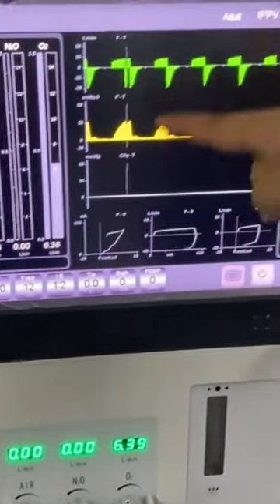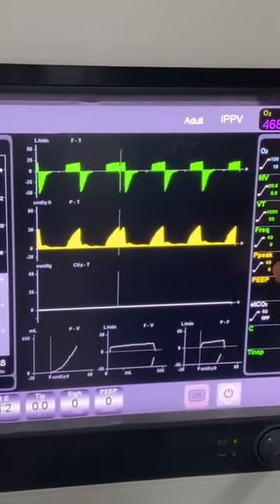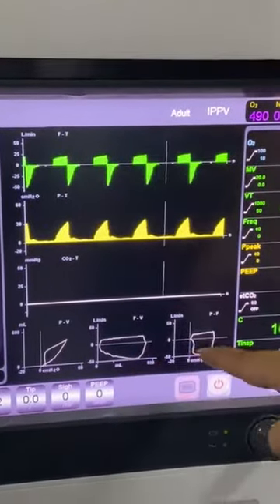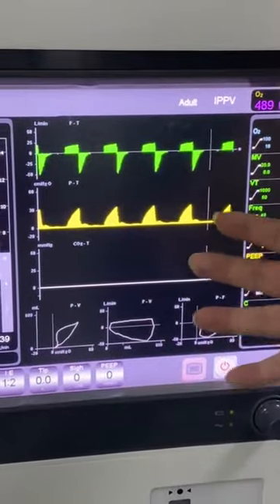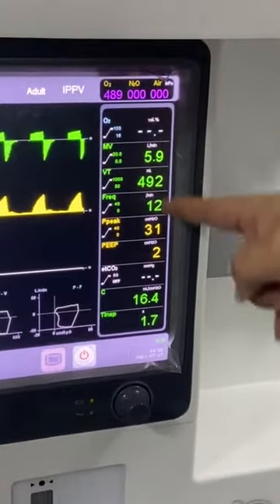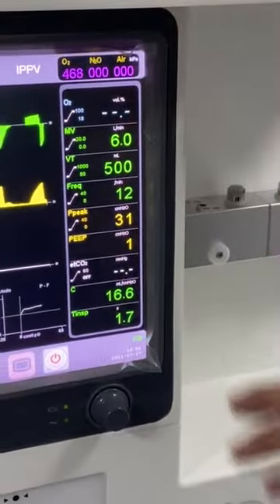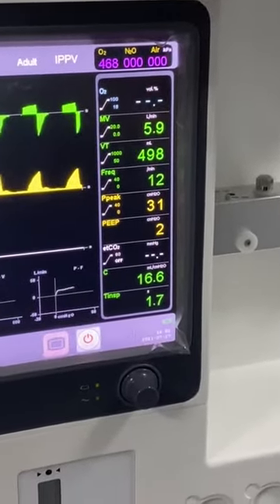And here the main side is the most important part because it has the biggest part, the waveforms. As you can see, for this machine we have 3 waveforms with 3 loops synchronously shown on the screen. It means 6 waveforms. And the right side here is for the monitoring parameters. All of these parameters are from the patient end. It means the doctors can read the monitoring parameters to know the patient's situation now, and whether we need to increase or decrease some parameters for the patient.